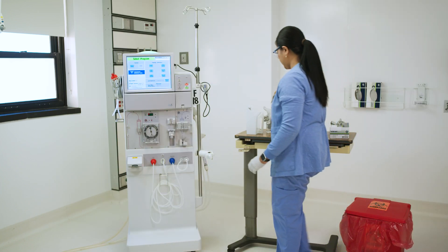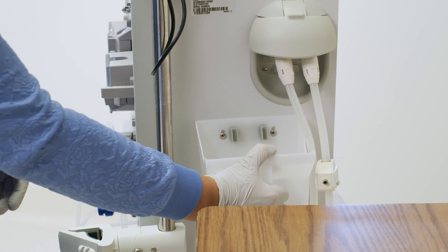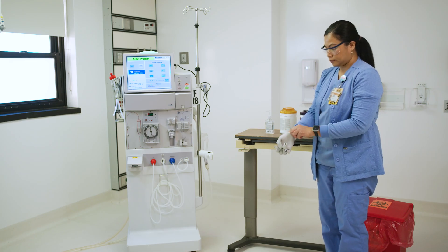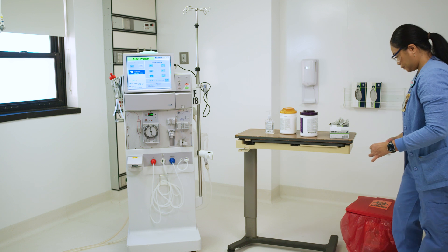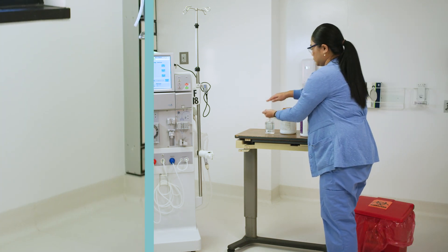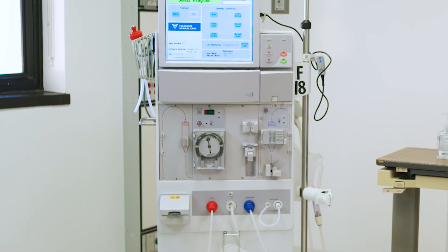Once the machine is thoroughly disinfected and the priming bucket has had time to dry, reattach it to the machine. Finally, doff your gloves and perform hand hygiene. Once these steps have been completed, your machine is ready for its next patient.